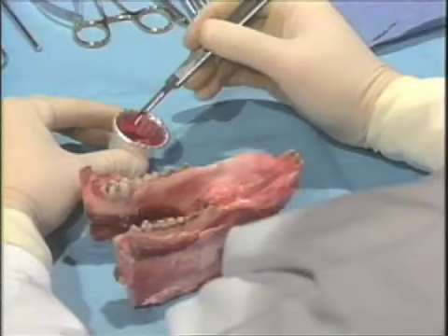In this series, we will demonstrate a number of initial incision, flap elevation, and suturing techniques. In this demonstration, we will use disclosing solution to highlight the position and placement of initial incisions.